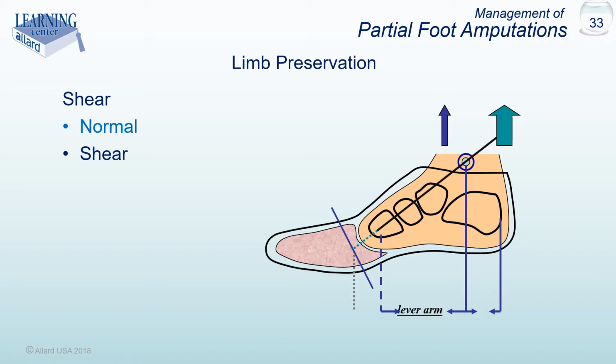The next step to manage shearing forces is the use of a carbon fiber foot plate. While these can disperse some of the shearing forces, they generally bend at the point of pressure and do not direct forces in any particular direction.